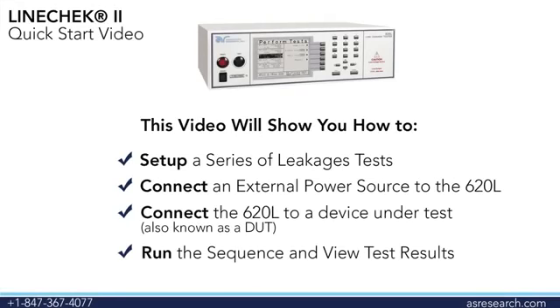During the course of this video, we're going to show you how to set up a series of leakage tests, connect an external power source to the 620L, connect the 620L to a device under test, also known as a DUT, run the sequence, and view test results.